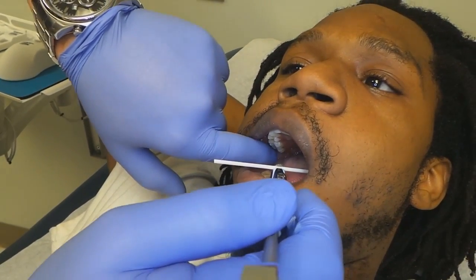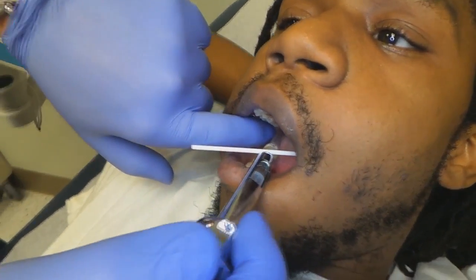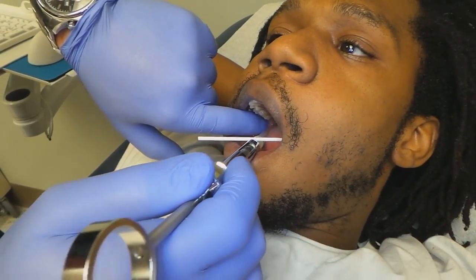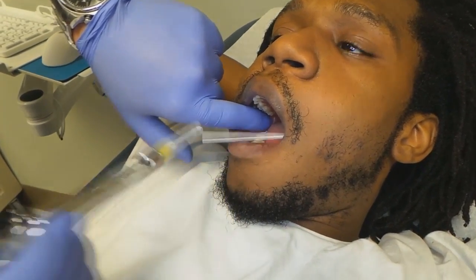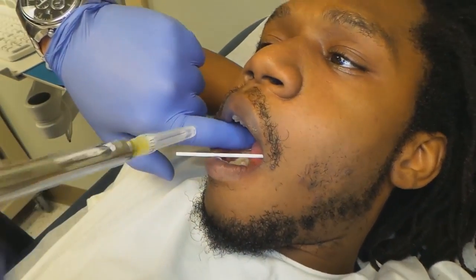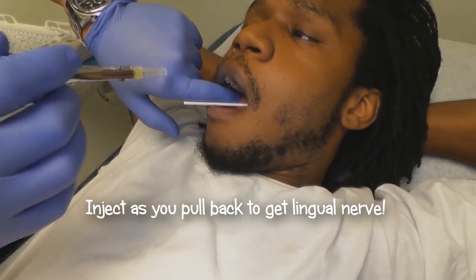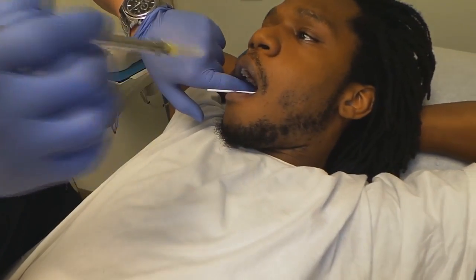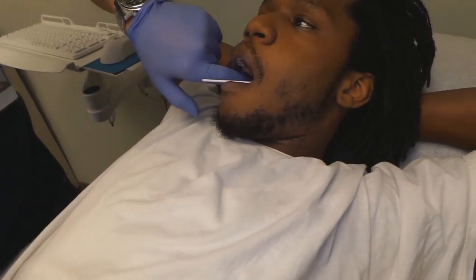I deposit about a half a carpule, and then as I'm pulling back, I just keep depositing a little bit more anesthetic. This gets the inferior alveolar nerve, and as you pull back, you're going to get the lingual nerve — the lingual is actually before that one. I give a little as I'm advancing too, but then when I pull back I start depositing it, and that usually gets the lingual nerve. It's a pretty easy one to get.